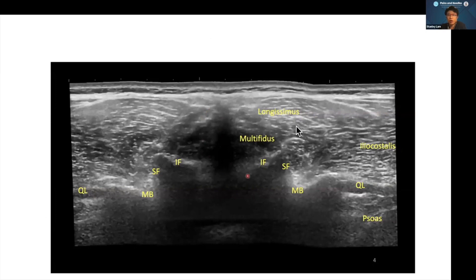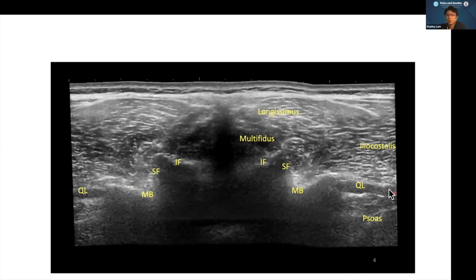This is just to reiterate what ultrasound will see at the lumbar spine: the interspinous region, the multifidus covering the inferior and superior articular pillars — which is the facet joint — and the medial branch outside the mammillary process, with the QL (quadratus lumborum) attached to the transverse process, and the psoas deeper to that. Outside the multifidus you have the longissimus and iliocostalis.